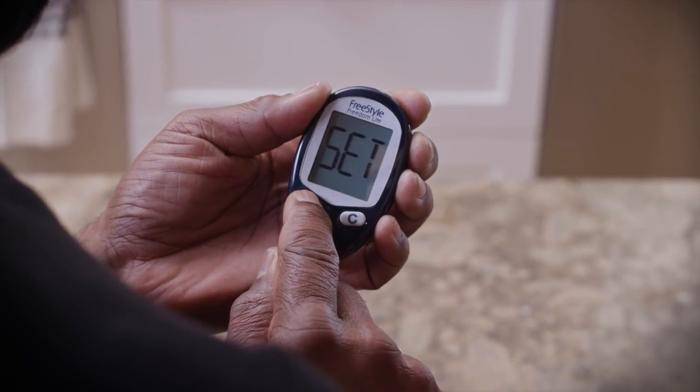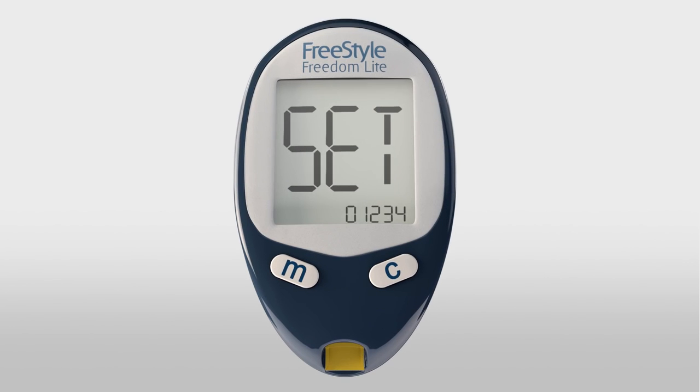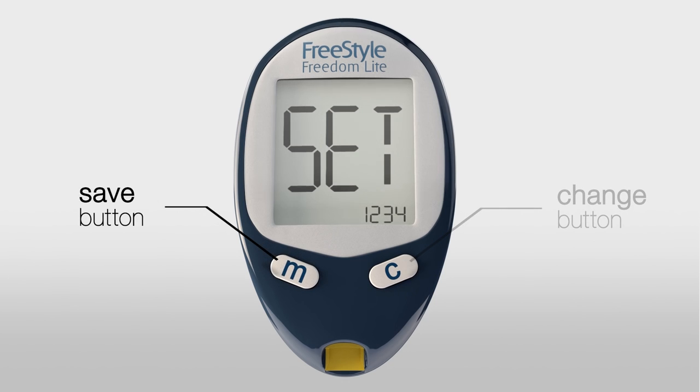With the meter off, press and hold the M button for 3 seconds until Set appears on the screen. The C or Configure button changes the setting. The M or Mode button saves your changes and moves to the next setting.